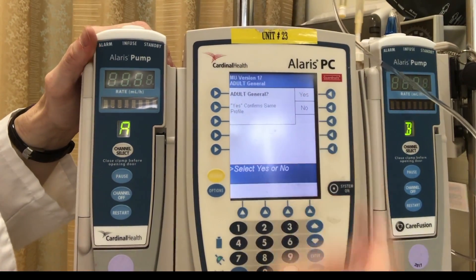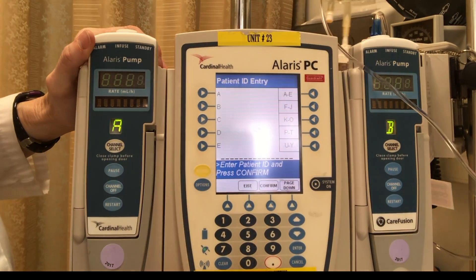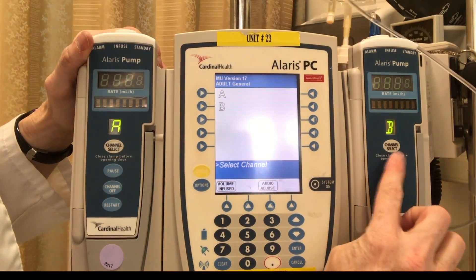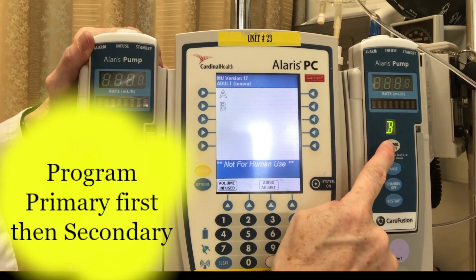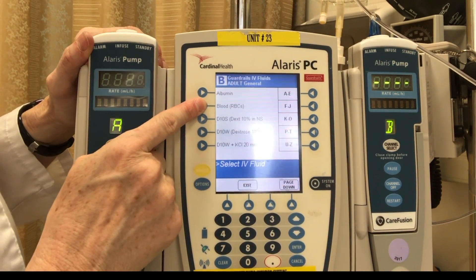We're going to select that this is a new patient, adult general, yes, and enter patient ID. You can simply hit confirm at this point. I'm going to select channel B because channel B is where my primary fluid is, so I'm going to select channel B over here.